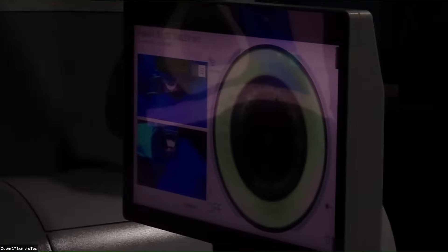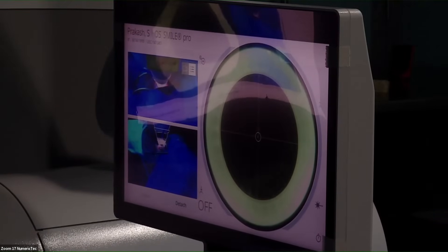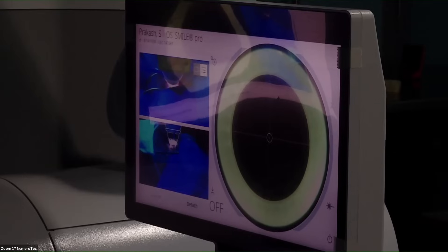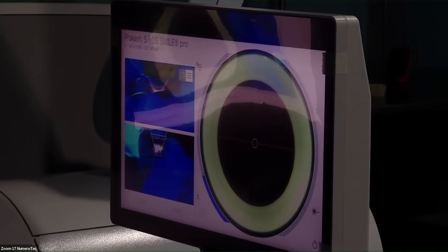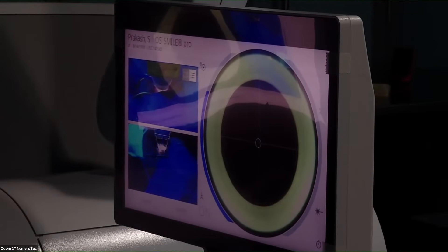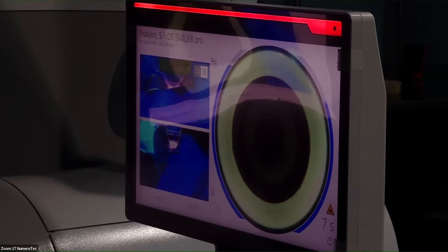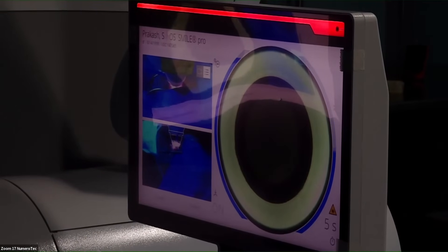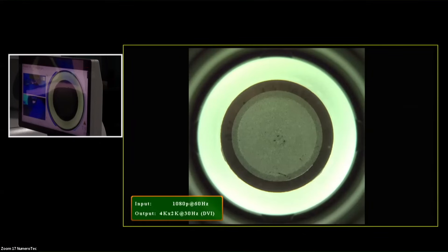This is the docking now for the second eye. Ask the patient to fix on the green light, center the pupil, and once you've got 70% application, hit the suction. When the laser is ready, apply it — that's the posterior cut, side cut, and the cap. That's all.